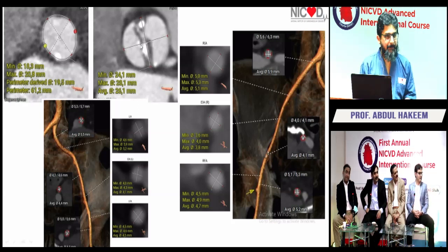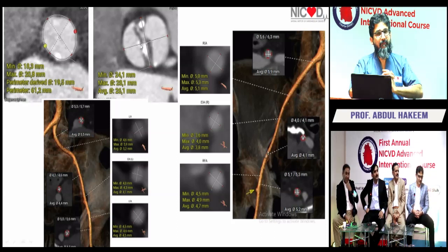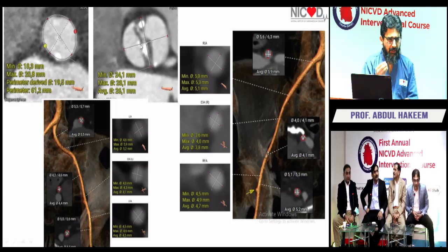We have only seen the femoral diameter here, but the aorto-annular angulation is not given. Yeah, there's a lot of things. I just wanted it to be a crisp discussion. So angulation was fair. Okay.